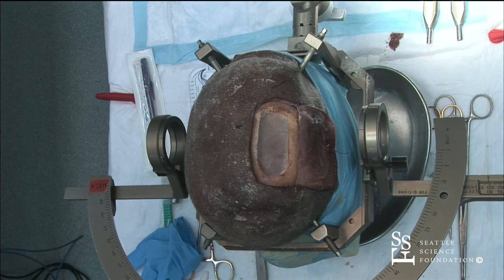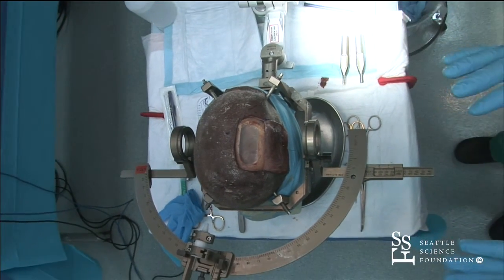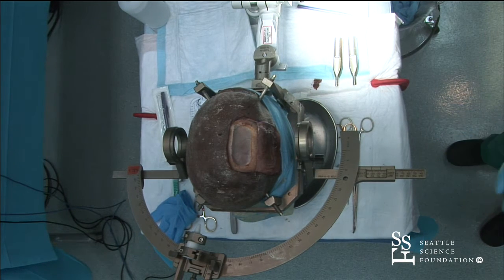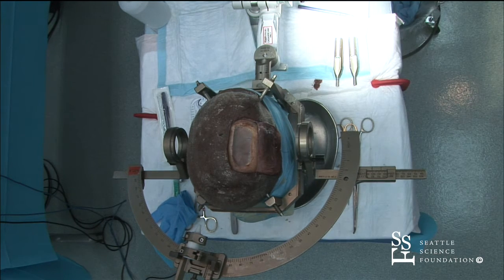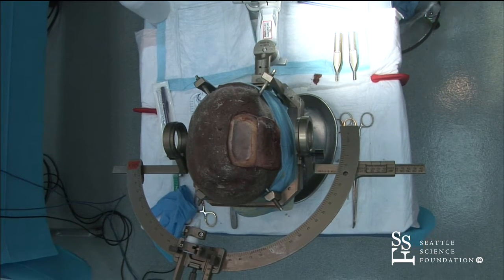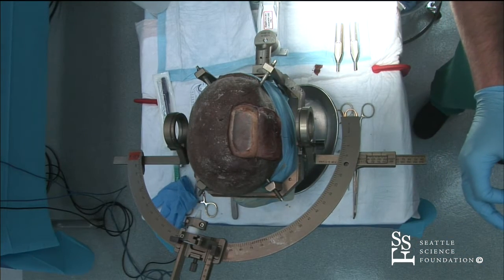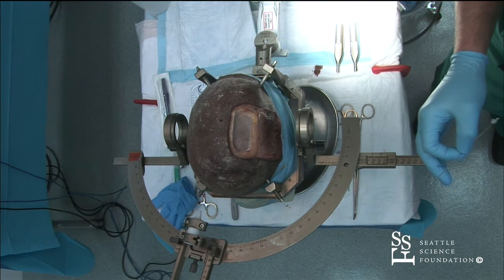So this is going to be a NeuroPace RNS implant for epilepsy, and with the RNS, we're accessing basically anywhere in the brain that we find the seizures to be coming from. So we might be putting in depth electrodes, we might be putting in strips. I have an example of each of those here. I'm not really going to demonstrate a strip implant today because it could be, again, anywhere, and really most of the time we just make a burr hole, slide it into the subdural space, and then tunnel it.